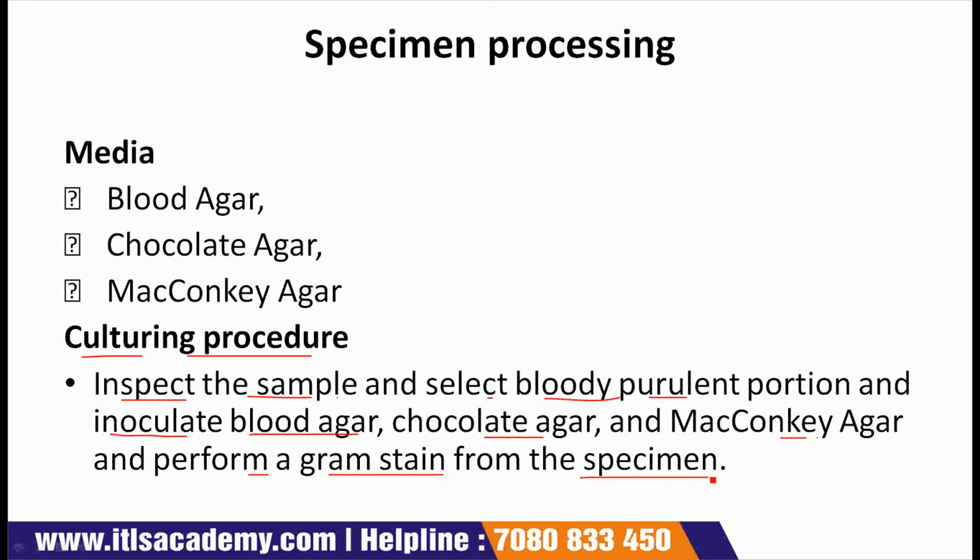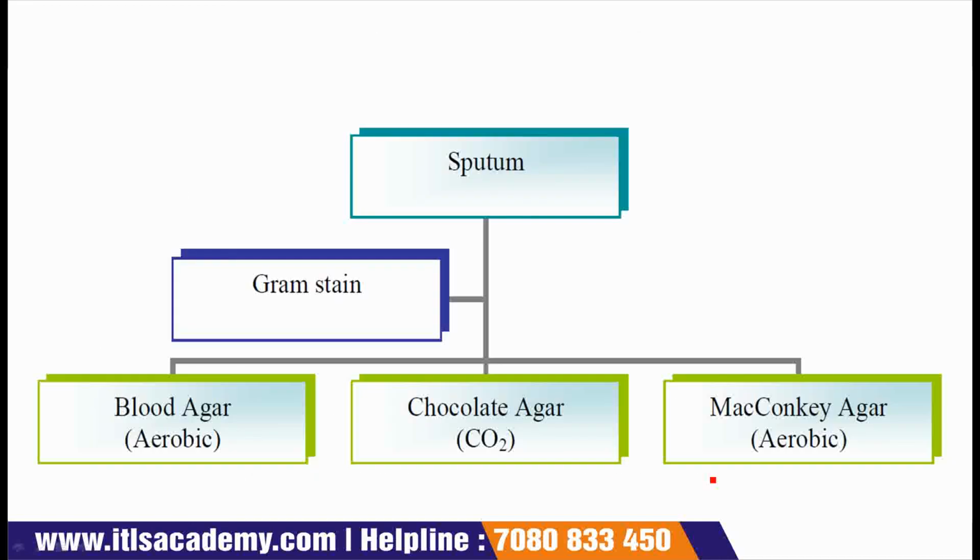You may be instructed to rinse your mouth out with water prior to collection and to avoid food for 1 to 2 hours before the sample is collected. You can see the culturing procedure, like sputum is collected. After the collection of sputum, gram staining is performed.